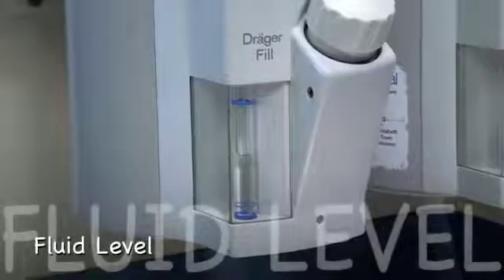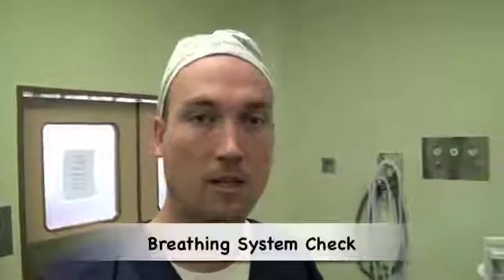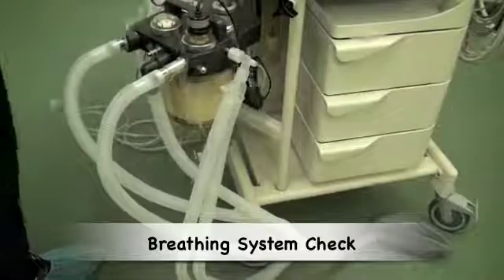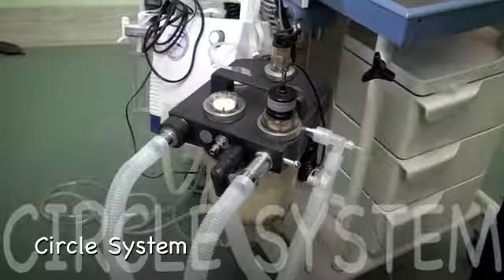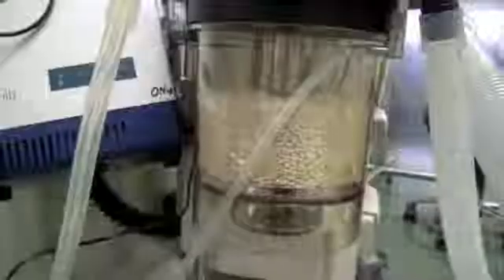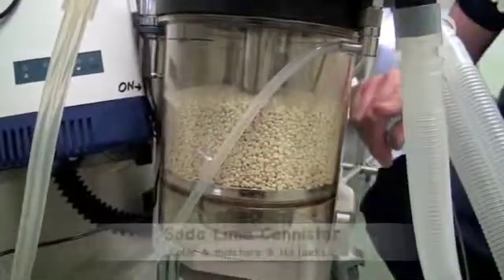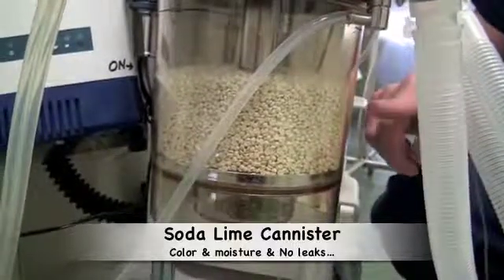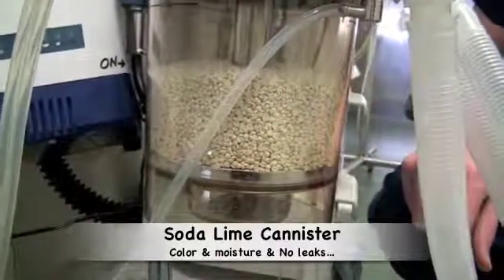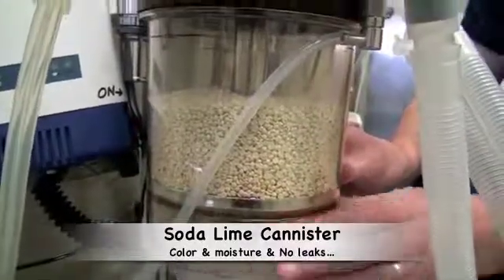One needs to check the level of vaporizer fluid within each vaporizer. Having checked the function of the anaesthetic machine, one now needs to check the integrity of the breathing system. In this particular machine, we have a circle system with a CO2 absorber. One needs to check that the soda lime within the CO2 absorber hasn't changed colour, that there isn't too much moisture within it, and that it is seated correctly on the machine without any leak.